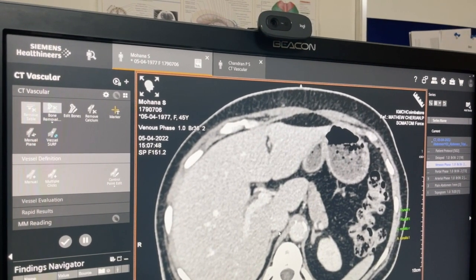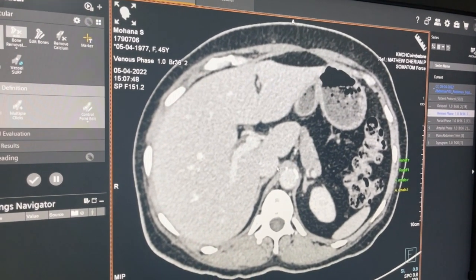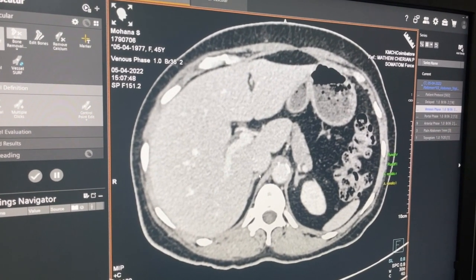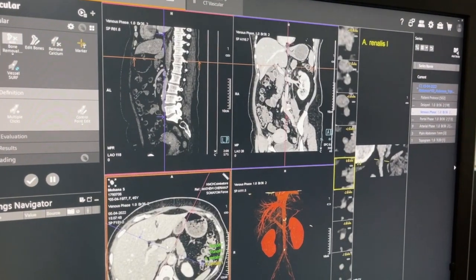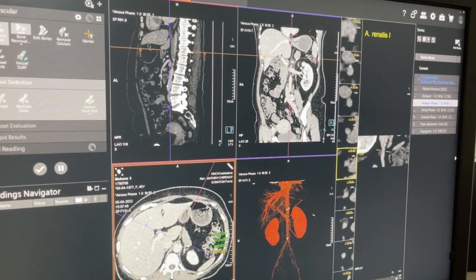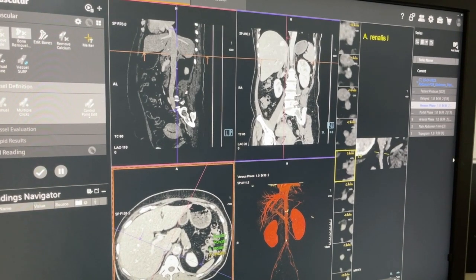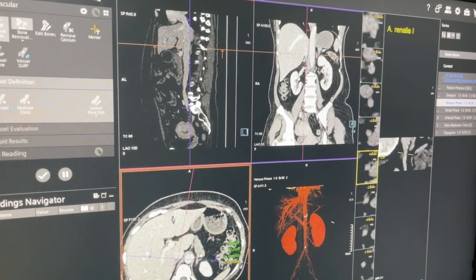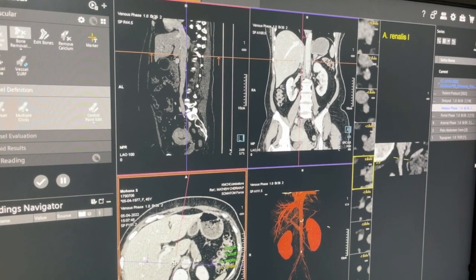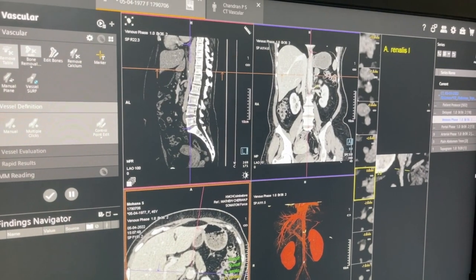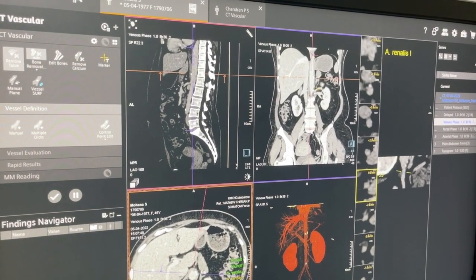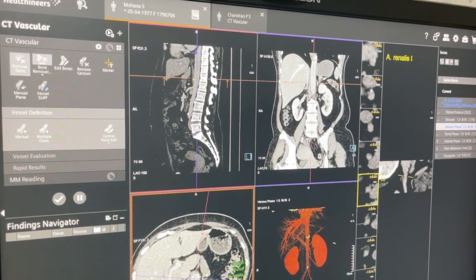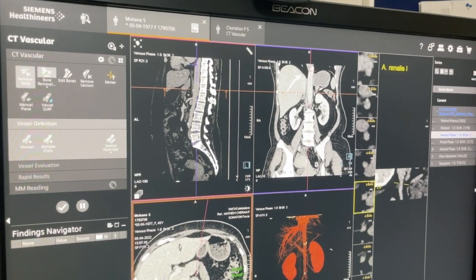You can try with a Sim 1, but sometimes it can wedge and go too deep, or you can try a Cobra 1, C1, or C2. You also need to know the vertebral level: put your cursor at the point where the right adrenal vein joins, then rotate to a sagittal view showing the spine. Step through the levels — it is approximately at the lower border of the D12 vertebral body. That landmark is extremely important for a 2 mm vein that is otherwise impossible to locate.